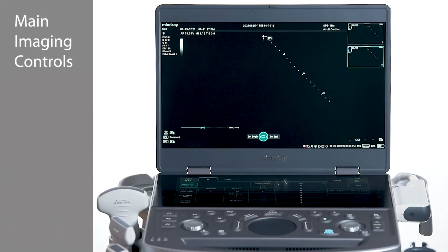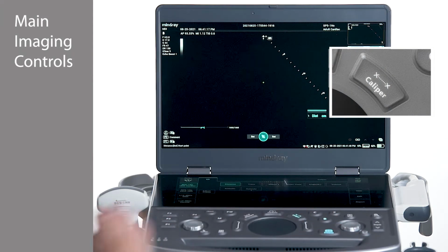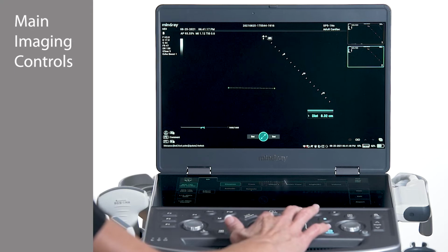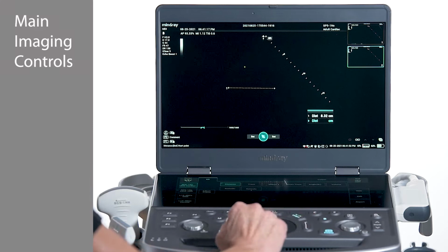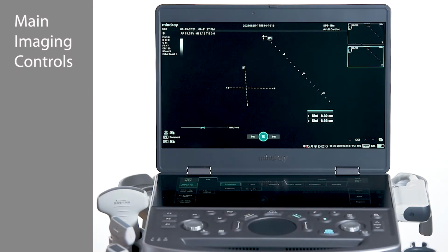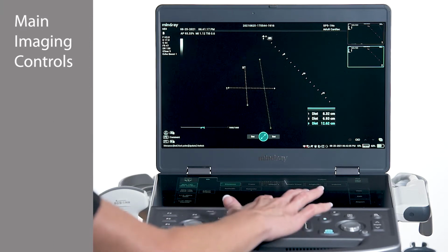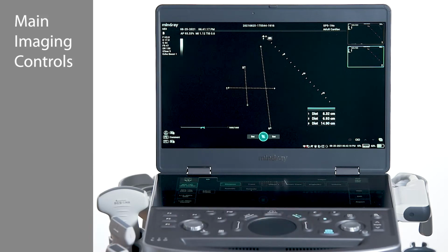Take a basic distance measurement by freezing the image and pressing the caliper key. Move a finger on the trackpad and drag the caliper to the desired start position of the measurement. Tap the trackpad after placing the first caliper to enable the second caliper. For multiple calipers on the image, tap the trackpad and slide a finger to bring up an additional caliper. The Update key above the trackpad will toggle between calipers to reposition if needed. Note that the caliper is green while active and turns white once it is set.